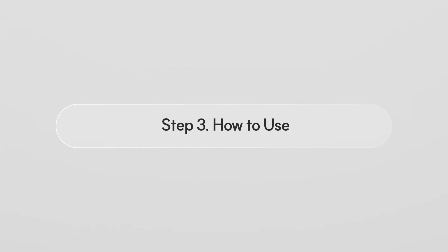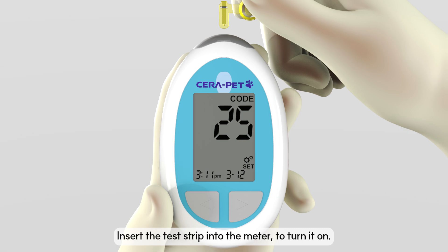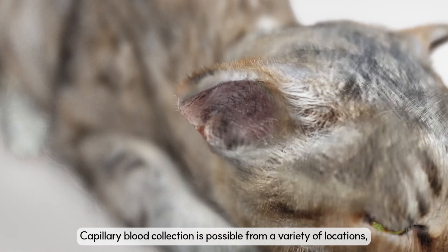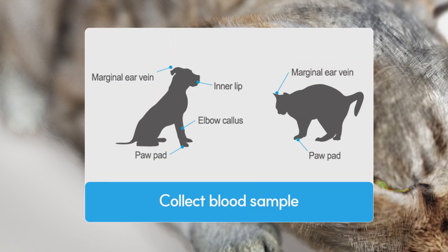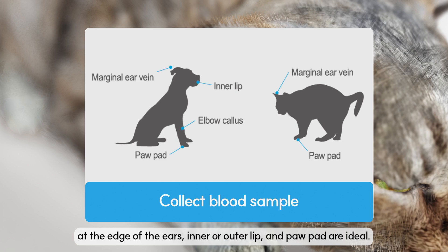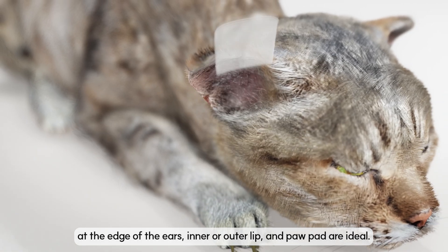Step 3: How to use. Insert the test strip into the meter to turn it on. Choose a sampling site. Capillary blood collection is possible from a variety of locations, but areas with little fur — such as the blood vessels at the edge of the ears, inner or outer lip, and paw pad — are ideal.